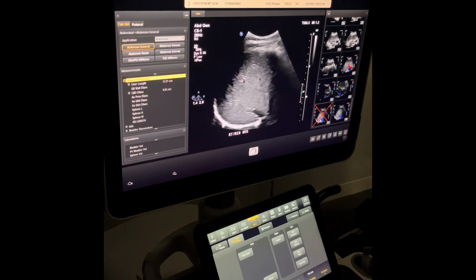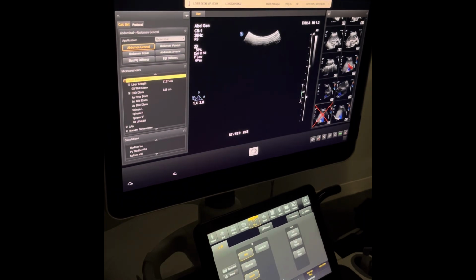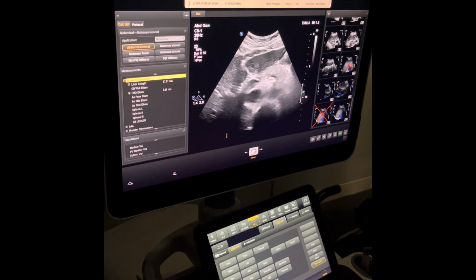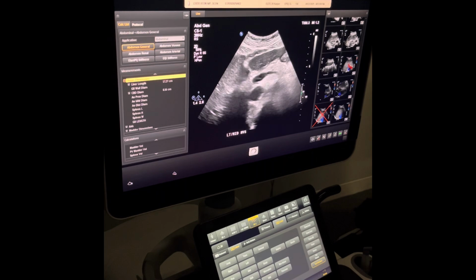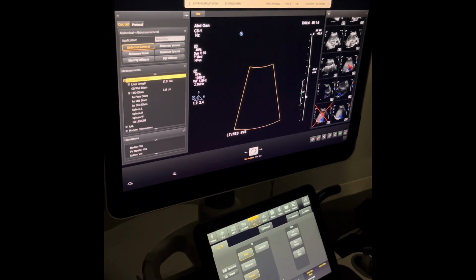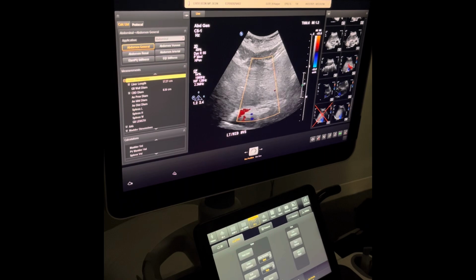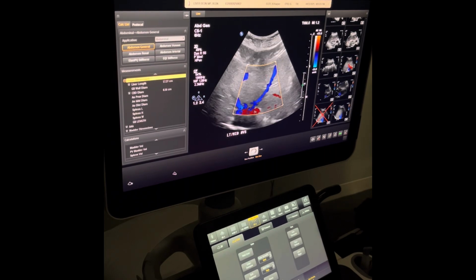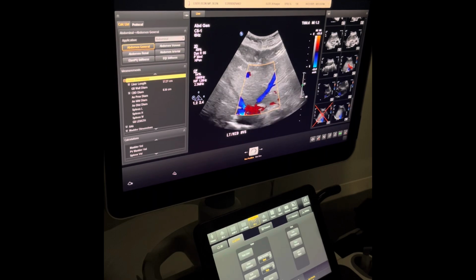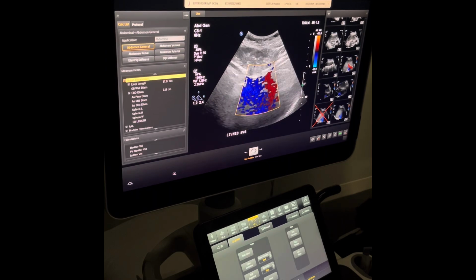And then to get the left, I'm just going to go back to where I was for the transverse sweep. Change that label to left and mid. Proof that I am getting left, I want to make sure I include mid in this image as well. And here I'm going to have my subject do a deep breath in and hold. And this will be our last image.